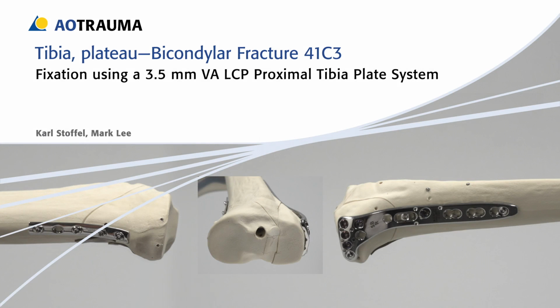Fixation using the 3.5 VA LCP Proximal Tibia plate system. In this exercise, the procedure for the fixation of a tibial plateau bicondylar fracture, type 4.1-C3, will be demonstrated using the 3.5 VA LCP Proximal Tibia plate system.